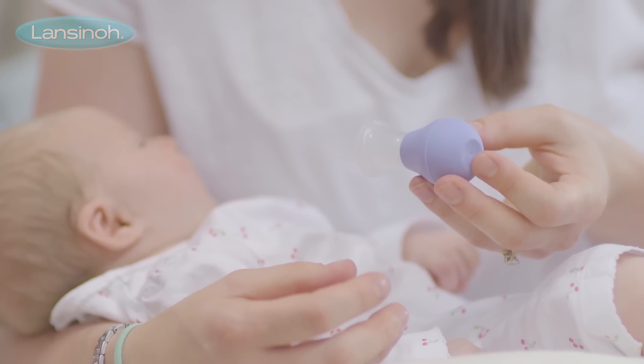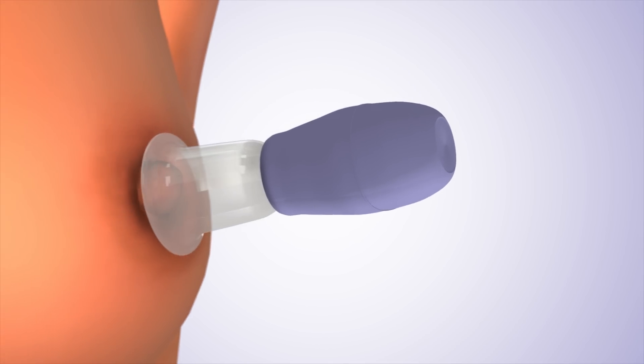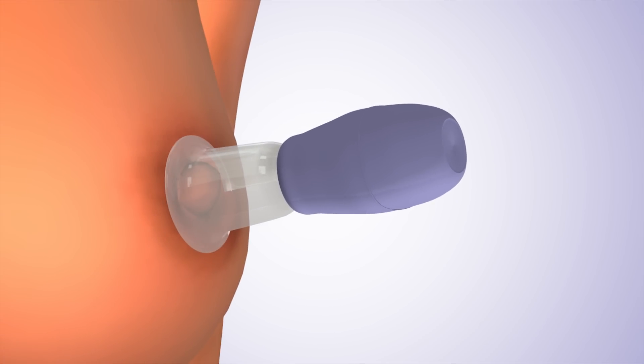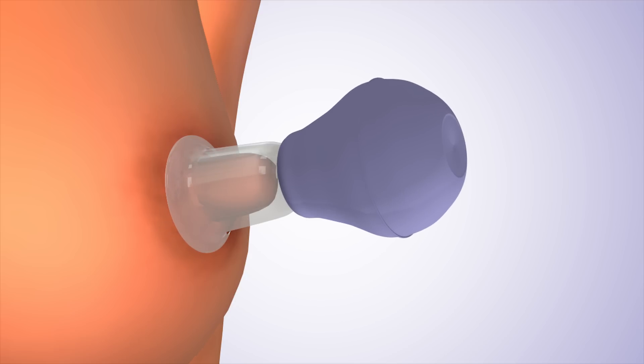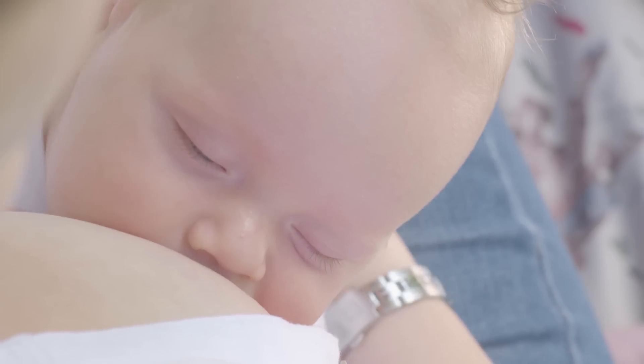With your baby in position, gently squeeze the bulb and place the shield over your nipple, lightly pressing it against the skin to ensure an airtight seal. Slowly release the bulb and repeat until your nipple is extended and your baby can latch onto the breast.